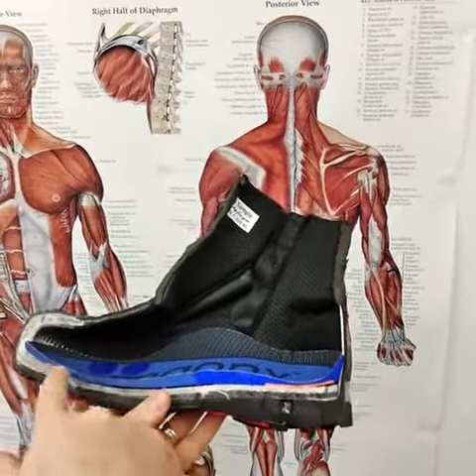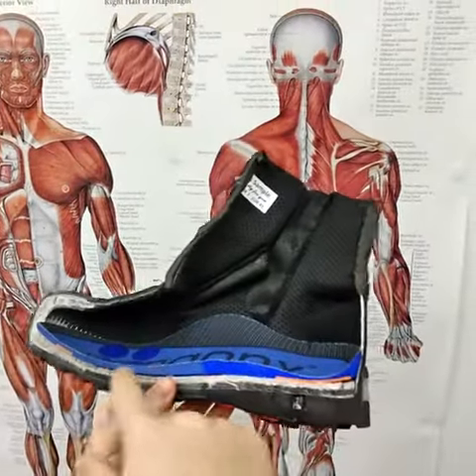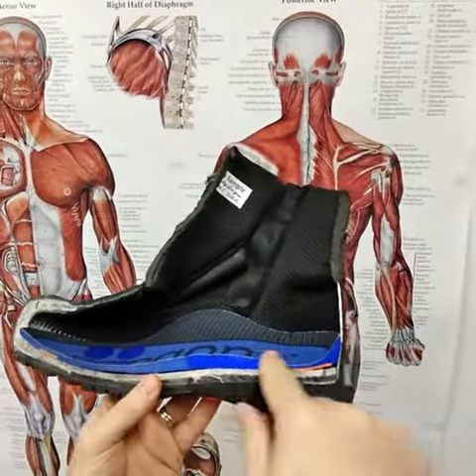If you have a look at the cross-section of our insole, you can see that it's not too thick through the heel and there's a lot of room to replace this with the custom-made orthotic.